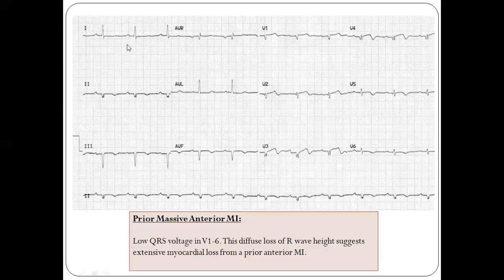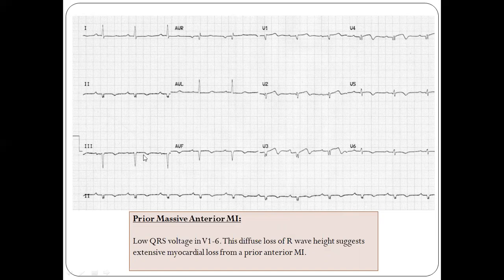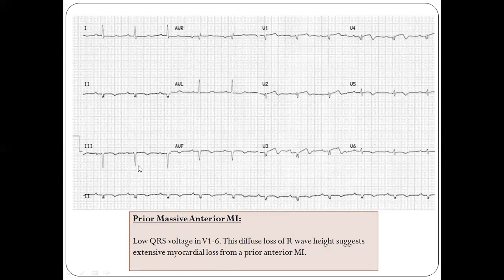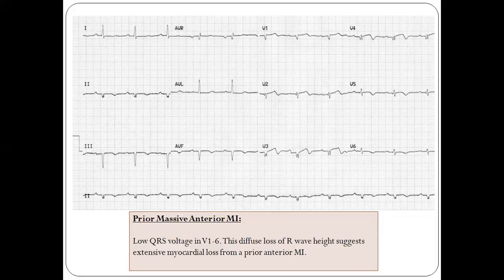Another cause you can see here is a prior massive myocardial infarction. You can identify this by the deep Q waves in the inferior leads — leads III and aVF showing deep Q waves. When you calculate the QRS amplitude in the chest leads, it is only about three to four small squares, which is less than 10mm, fitting the criteria for low voltage ECG.